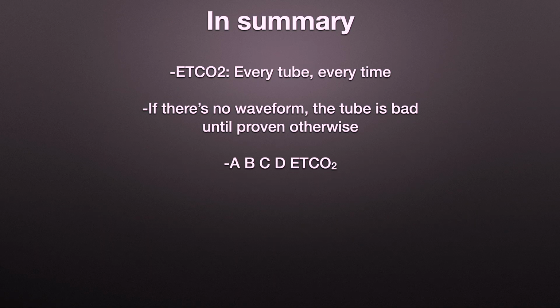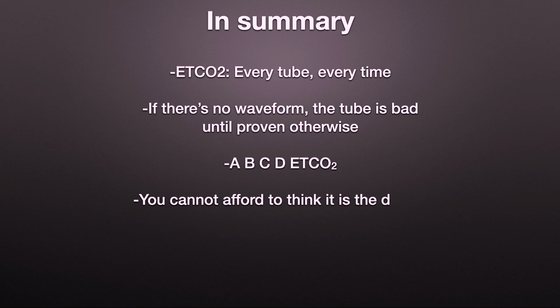End tidal CO2 is a vital sign, and hopefully we make the case that that should be used on many of our critically ill patients, if not almost all of them, in one way or another. You can't afford to assume it is the device. I've said that before, and I'll say it again. You can't afford to just think it is the device that has gone wrong.